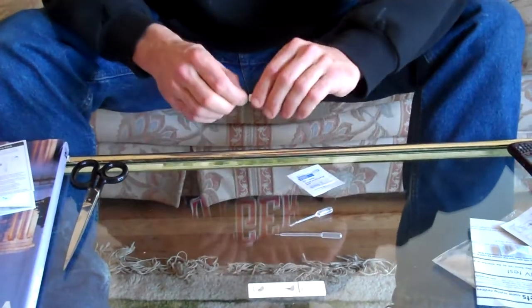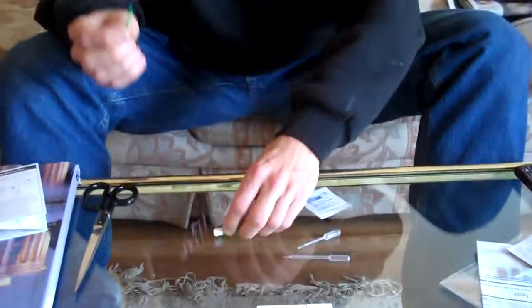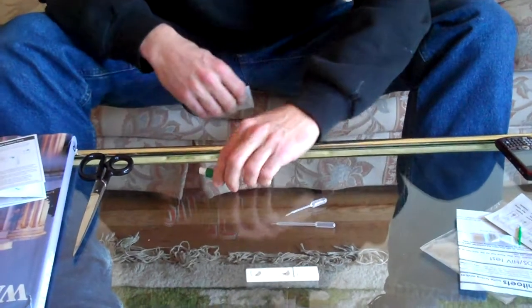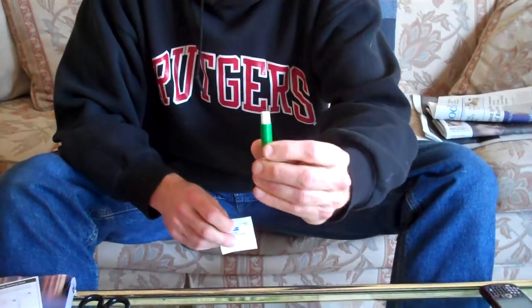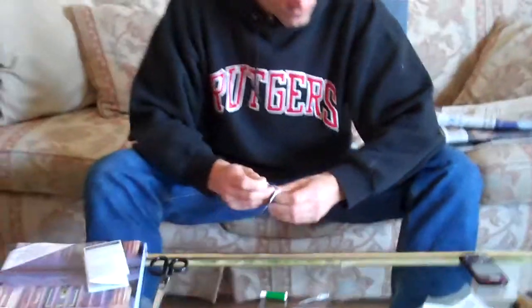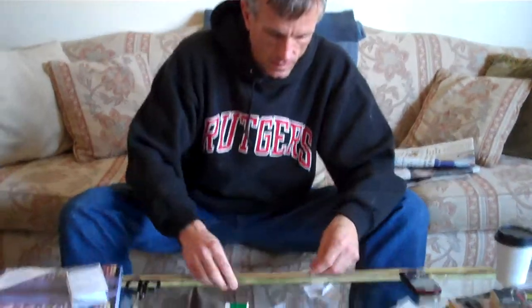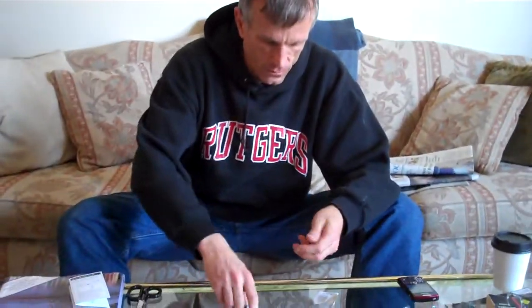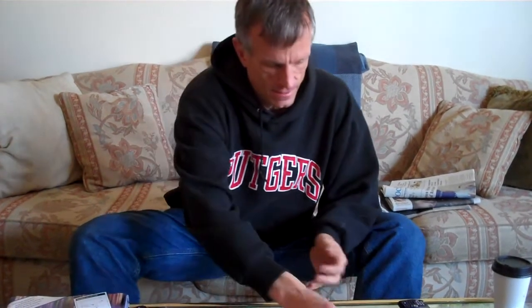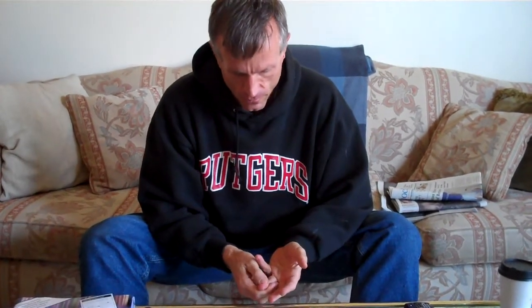First thing is I will take this protective piece off so that the needle is exposed. You don't see any needle, and you won't see any after the test. It's going to spring out and go right back in, so there are no needles to be concerned about. Now this is the worst part — it's pricking my finger. But it's really not that bad; I'm just more of a wimp.